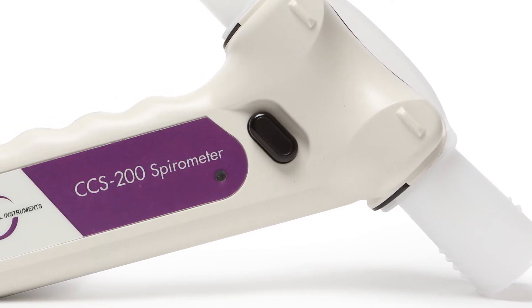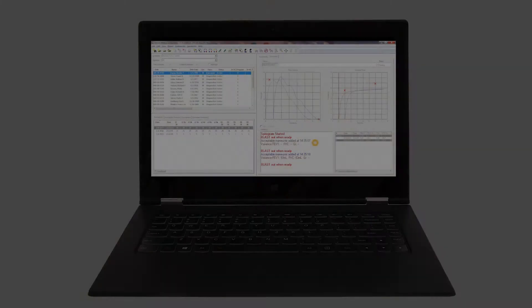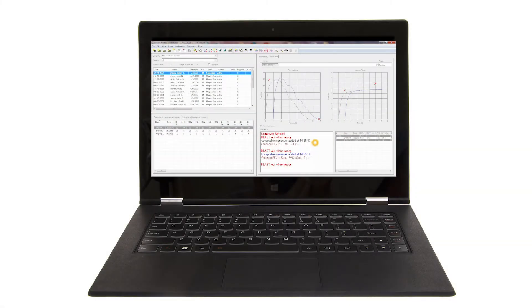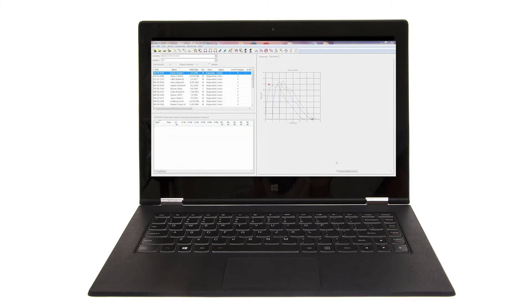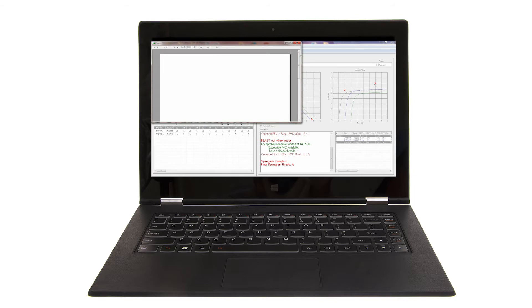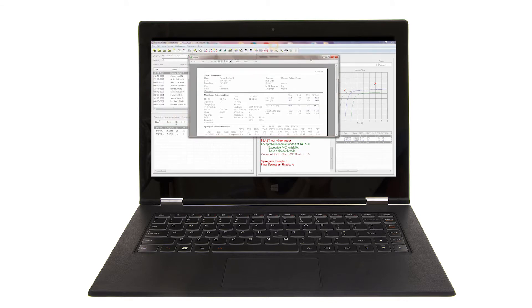Both instruments are computer controlled, so they are easy to use and will conveniently store, analyze, and report your occupational health testing data.